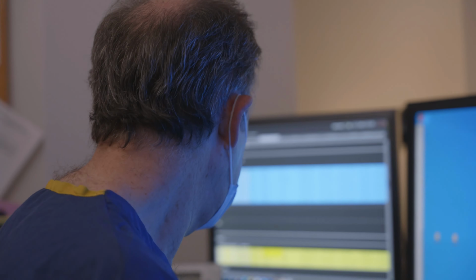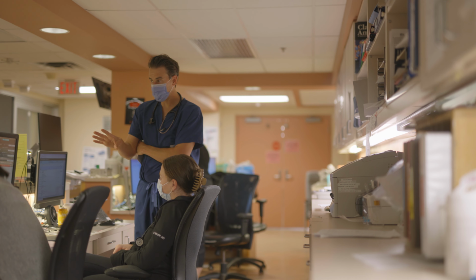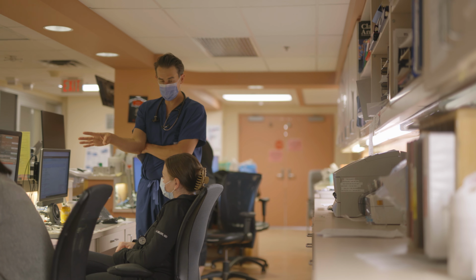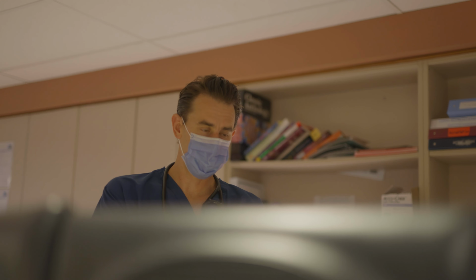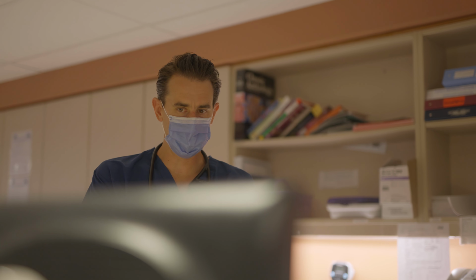A functioning CT scan machine is very important to my work because when I'm working here in the intensive care unit, I require rapid access diagnostic testing to make the diagnosis that serves the patients in terms of deciding what treatments I want to give them. I can do my clinical examination using my stethoscope and bedside assessment, but I need diagnostic tools like the CT scanner to diagnose things like blood clots, brain bleeds, strokes, and surgical problems that require critical intervention. I order a CT scan for about 25% of the patients that I see, and roughly half of the patients I care for in the intensive care unit require a CT scan for me to accurately diagnose what's wrong and come up with the right treatments to help them.